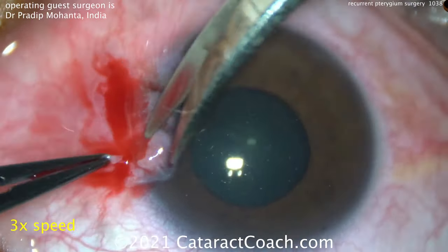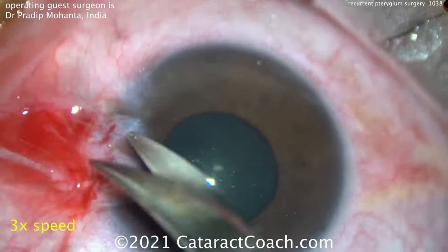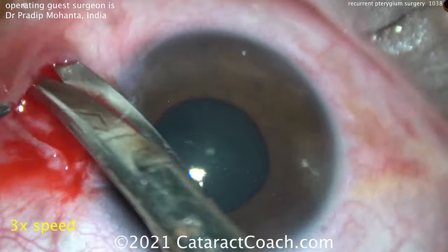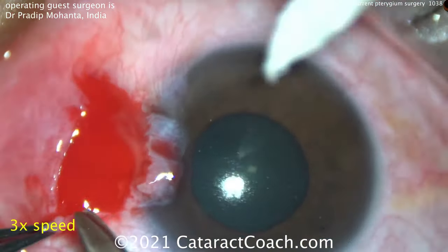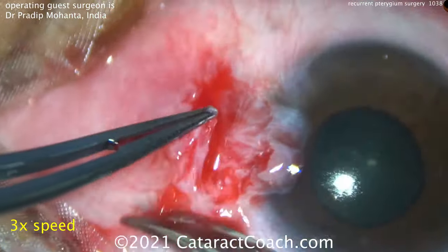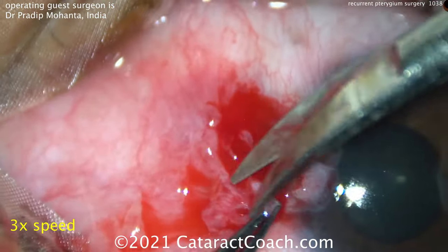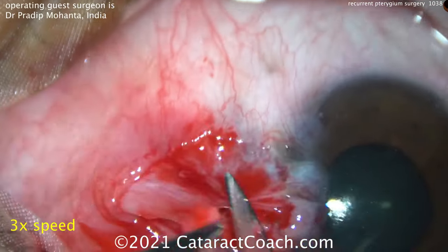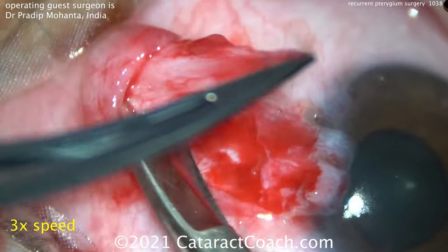With a recurrent pterygium and previous surgery, you can't just lift the pterygium off the cornea and pull it off — it's not going to peel off that easily. You've got to do a lot of dissection there, very carefully. That's a very important part of this surgery: you want to separate that conjunctiva without damaging it from the underlying pterygium.